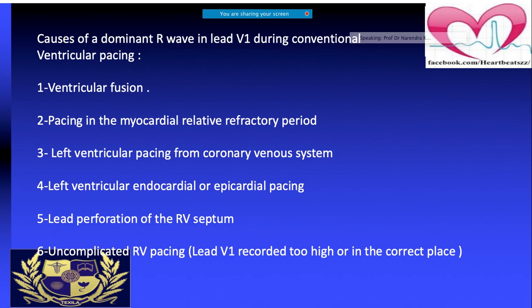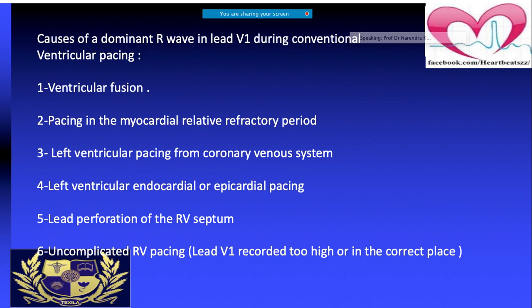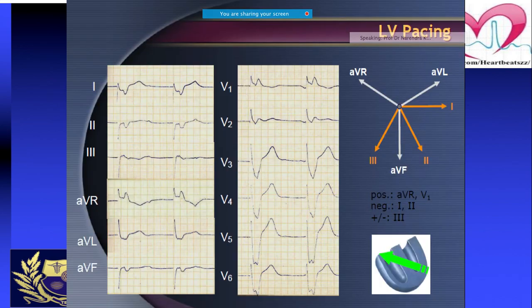The causes of dominant R wave in V1 during conventional ventricular pacing may be: ventricular fusion, pacing in the myocardial relative refractory period, LV pacing from the coronary venous system, left ventricular endocardial or epicardial pacing, lead perforation of the RV septum, or even uncomplicated RV pacing.